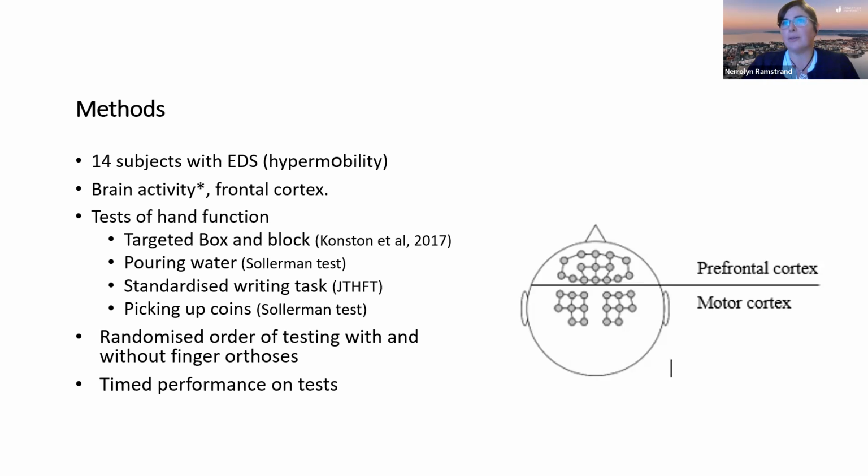And then we had a task where they had to pick up coins from a table and put them into a purse. We randomized all the order of testing. So some started with finger orthoses on and some started with finger orthoses off, but everyone did all of the tests. We also measured timed performance on the tests. These are standardized, validated tests. So we measured timed performance on those as well.